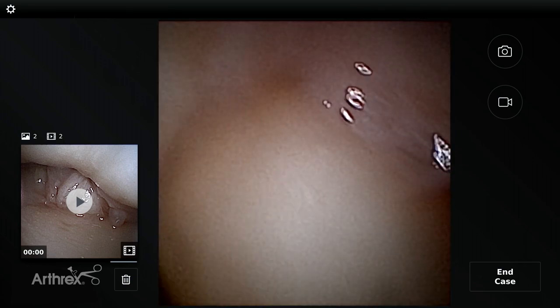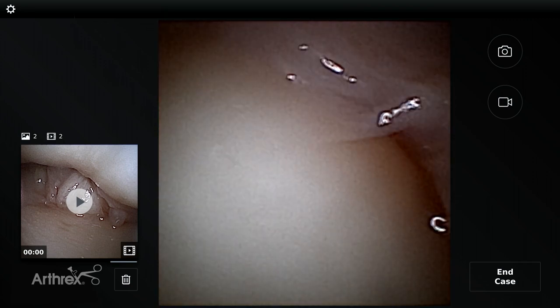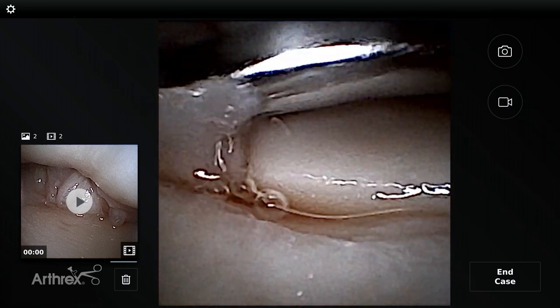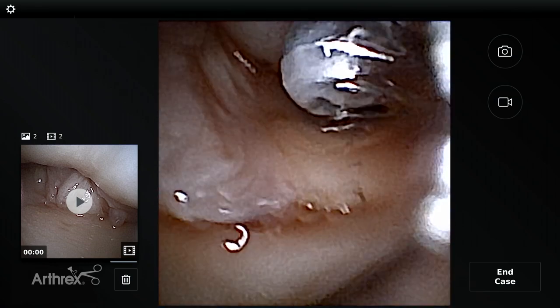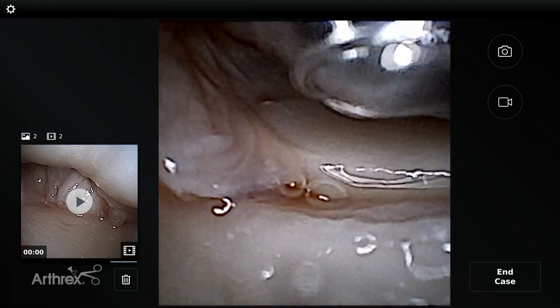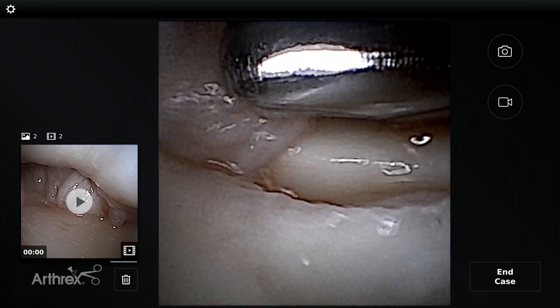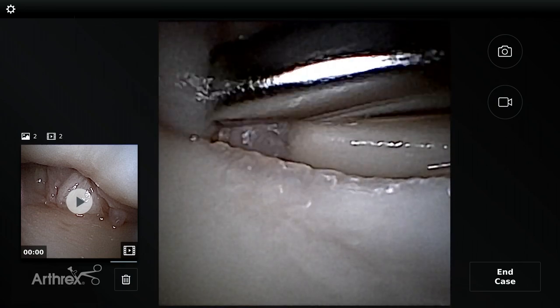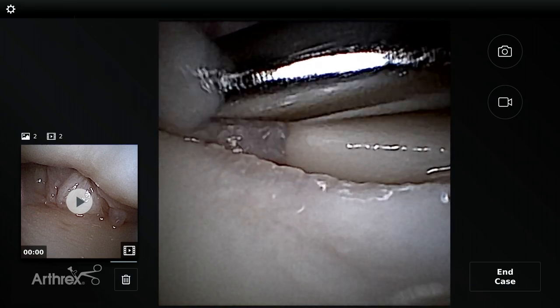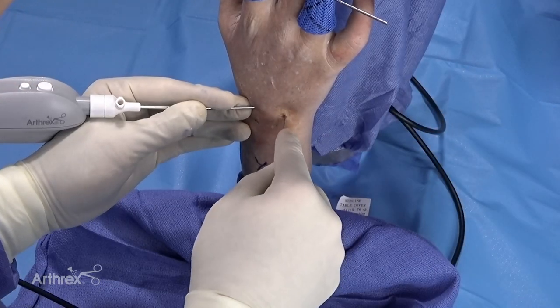Today we're doing a therapeutic procedure in a procedure room, but doing it dry gives you an unparalleled view. I've introduced the small joint arthroscopic shaver — this is a 2.0 shaver. Under dry arthroscopy, I call this the 'hair dryer maneuver': we can simply suck out the synovial fluid. If there's blood in the joint, we can do an automatic washout. Here we're performing a synovectomy in the lunatotriquetral joint to clear the joint out and then assess the carpus for any carpal instability.